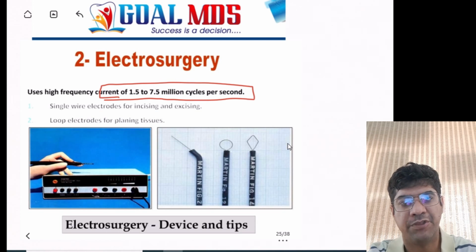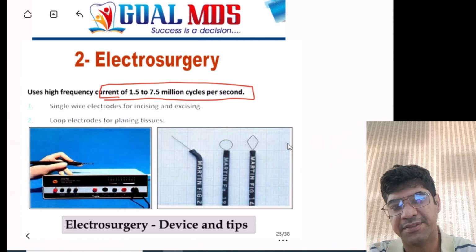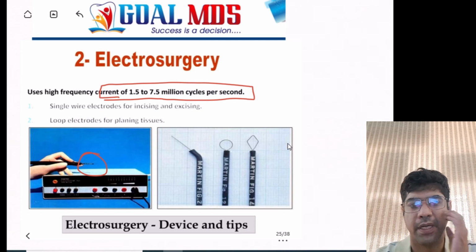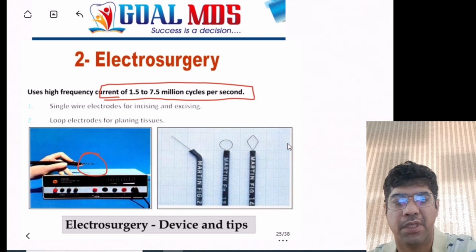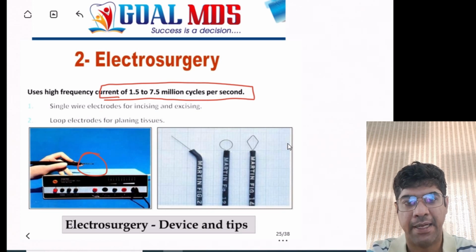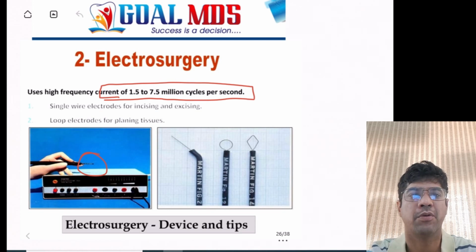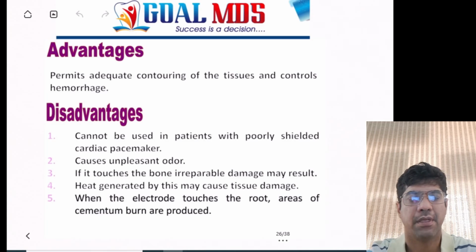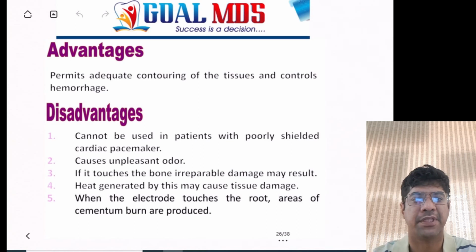The patient first of all is prepared for the procedure, often with local anesthesia to numb the area. The area is isolated. A specialized instrument known as electrocautery is used that consists of an active tip and a grounding pad. The active electrode is used to apply the electric current to the tissues and create incisions, and the electric current cuts the tissues and also cauterizes the blood vessels to control the bleeding. The excess material is removed using the electrosurgical instrument.